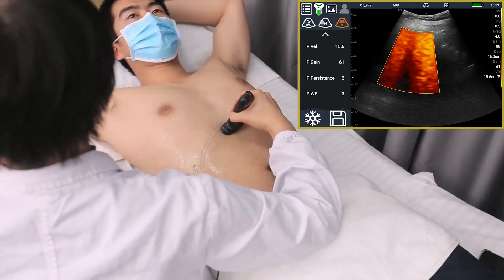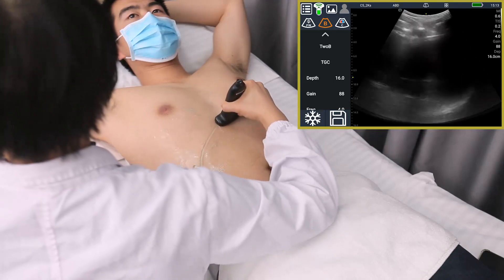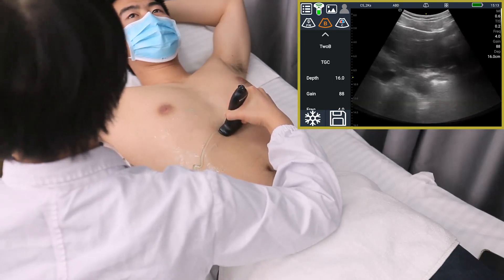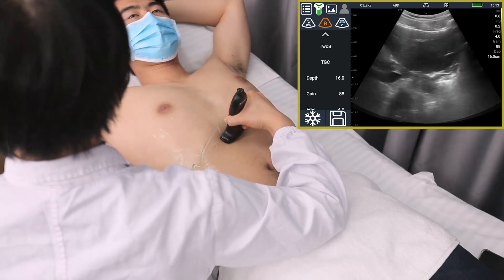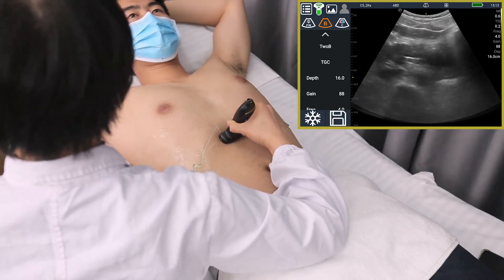Then scan the pancreas to observe the shape and size of the pancreas, whether the boundary is clear, whether the pancreatic duct is dilated, and observe the head, body, and tail of the pancreas.